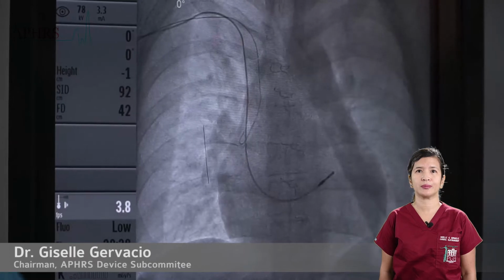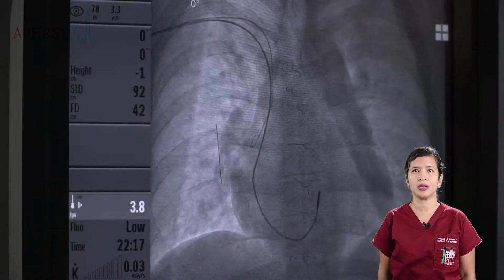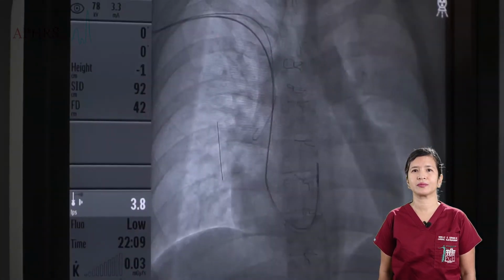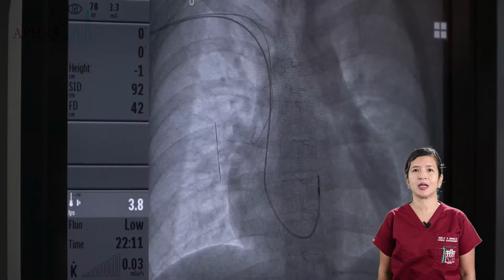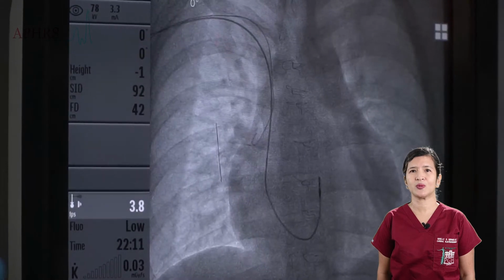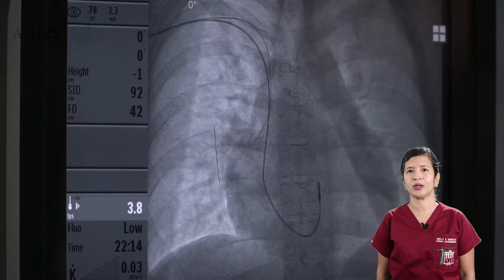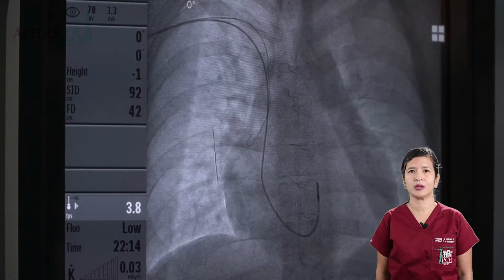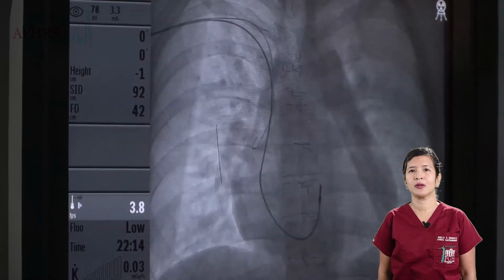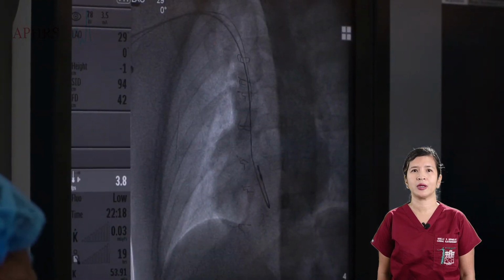of the His bundle. At this point, preliminary R waves may be measured, as well as checking for capture at 2 volts. This position is still slightly high with smallish R waves, hence we proceeded to pull the lead out a little lower until it caught at the area of the His bundle. A counterclockwise torque is applied to the lead to increase the probability of lodging it at the His bundle area.